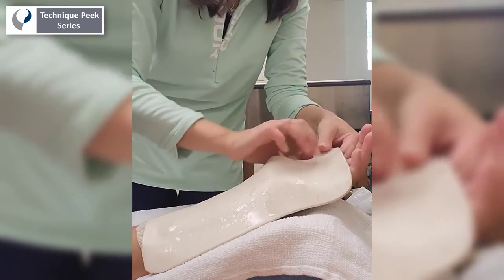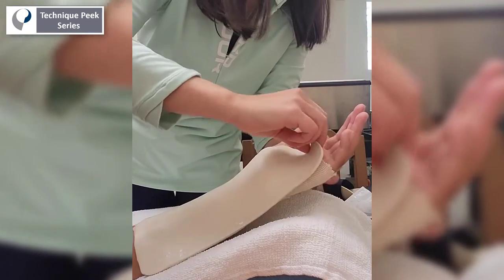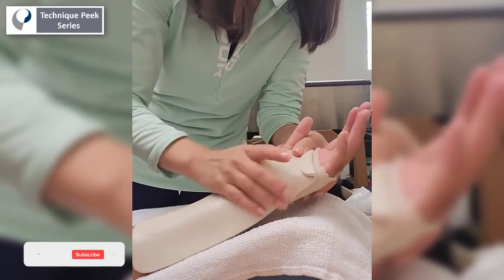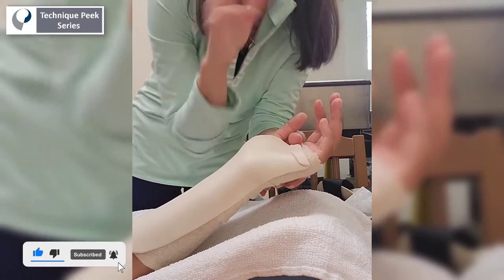Next, we want to mold the splint in the proper position for maximal flexion of the MCP joint. Taking into consideration the tenodesis response, it's helpful to place the wrist in slight extension during the initial molding.